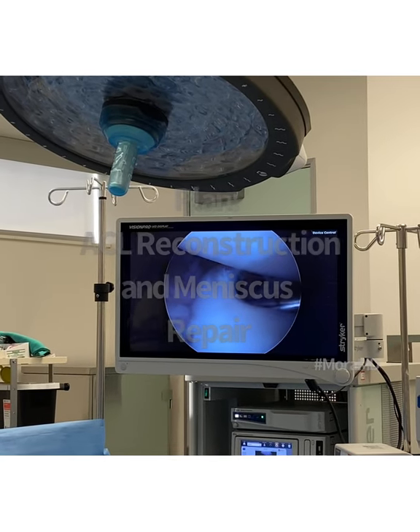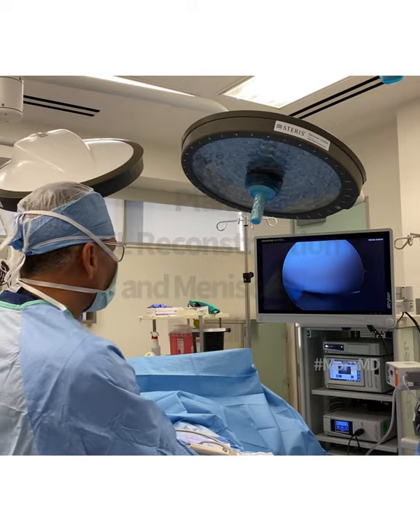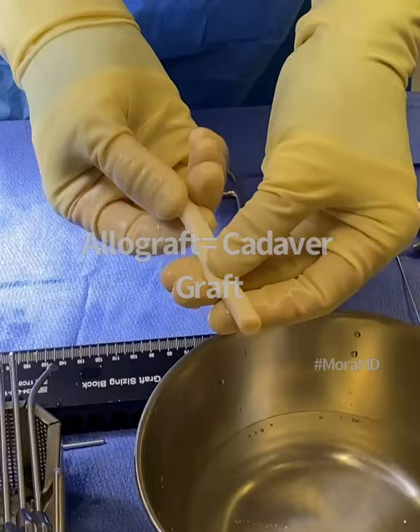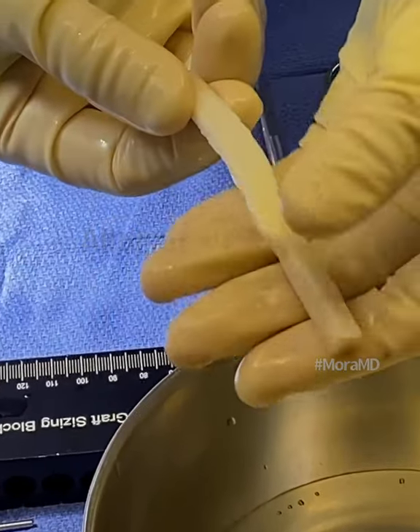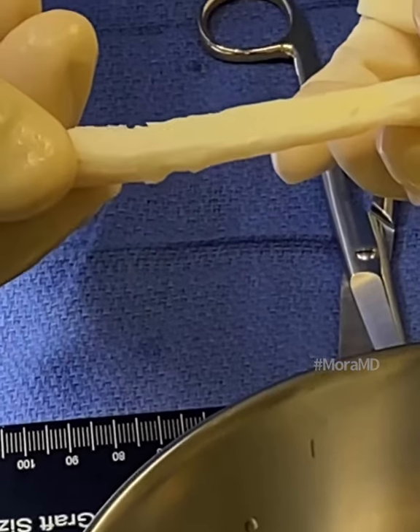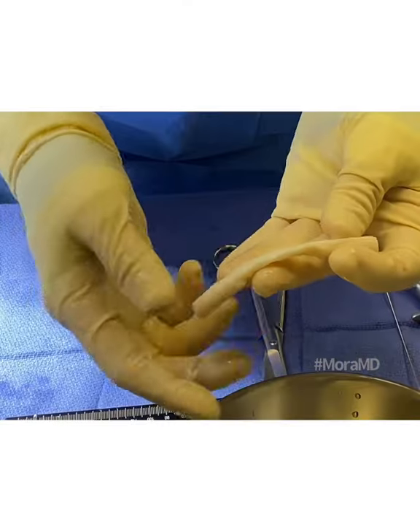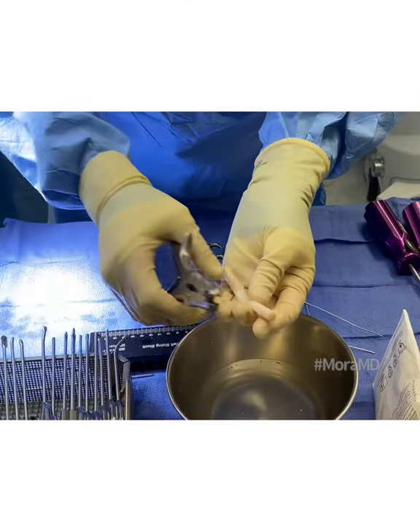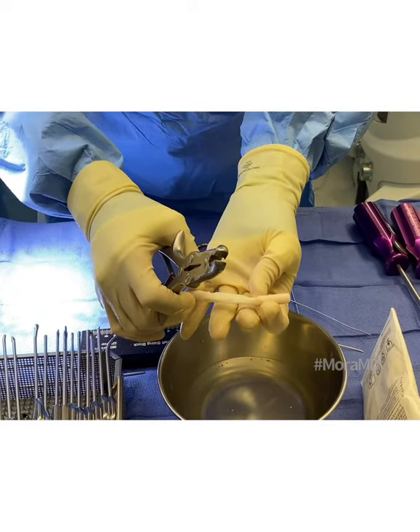So I'm going to be doing a medial meniscus repair and ACL reconstruction today. This is a bone-patella-tendon-bone allograft — that's what we're doing today. Beautiful looking graft. It's basically a cadaver graft — that's the tendon, and those are two bone plugs. I'm going to trim them with this bone trimmer so that it fits the tunnels in the knee.